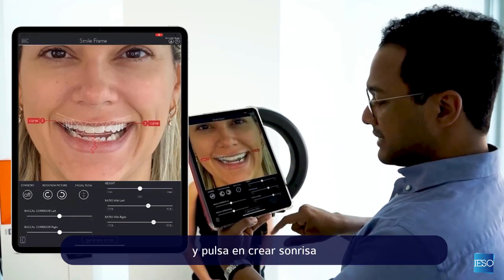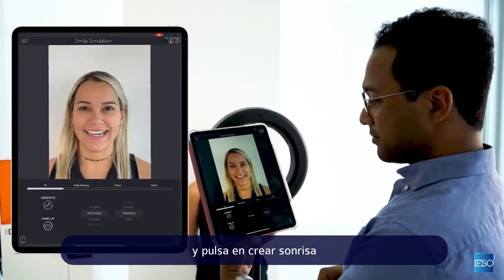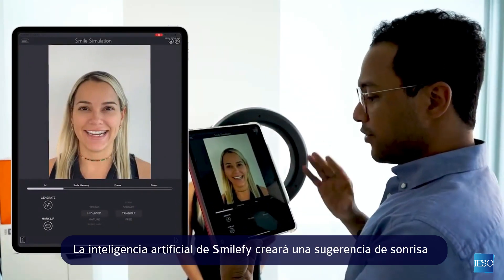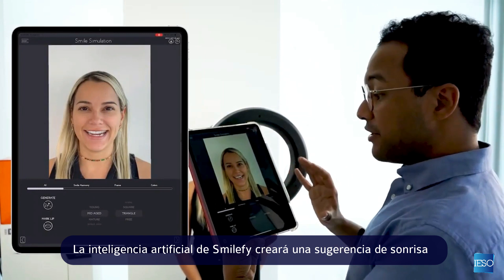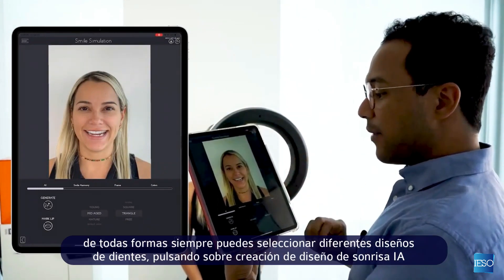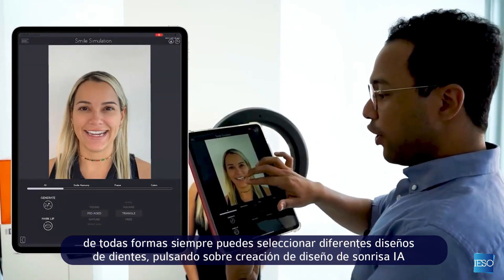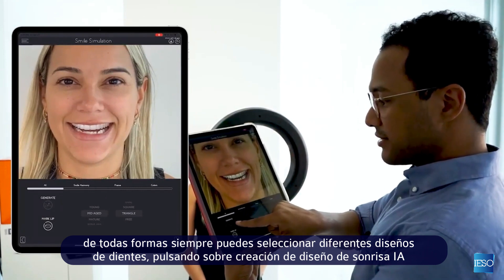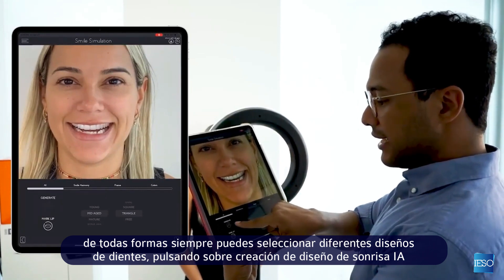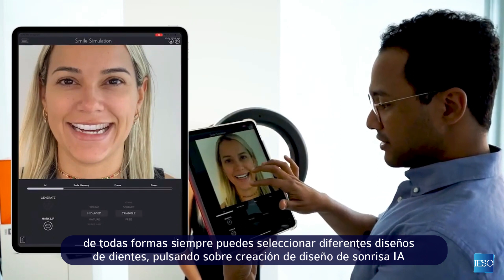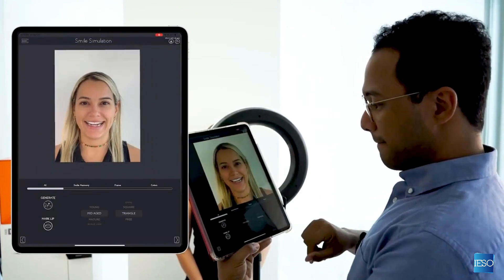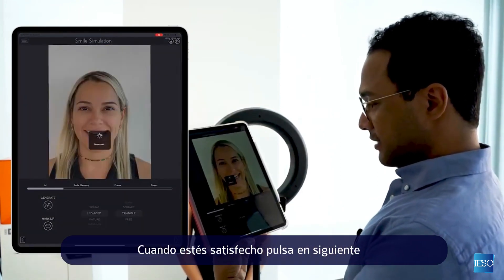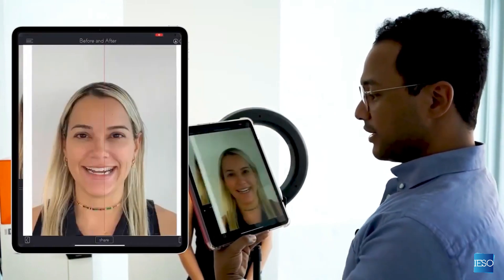Tap on Generate Smile. The artificial intelligence of Smile 5 will give you a suggestive smile. However, you can always select different teeth designs by tapping on the AI Generate Smile Design. Once you're satisfied, tap on Next.